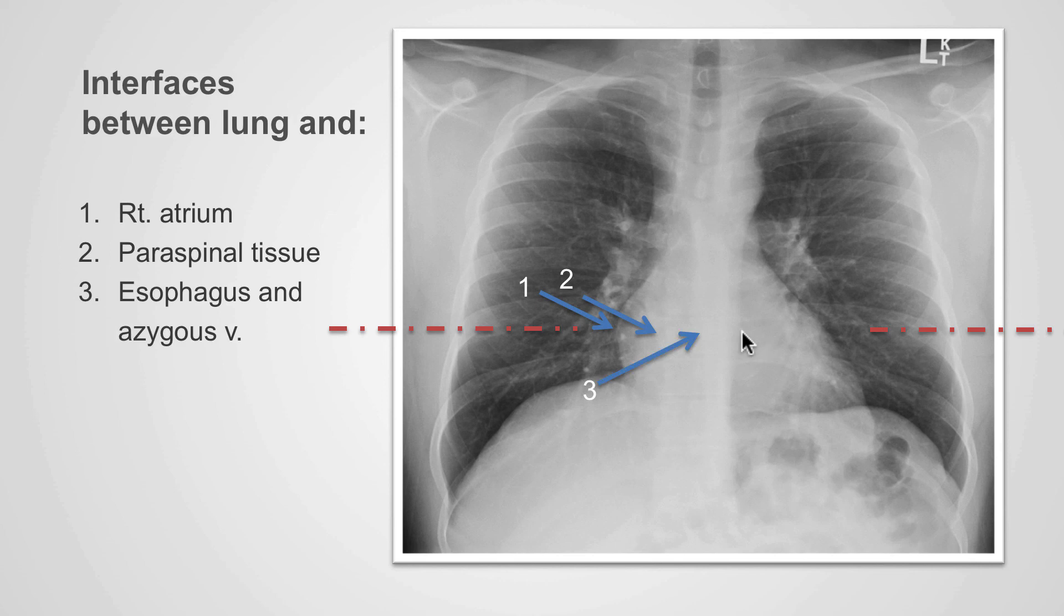Can you identify what is causing this interface? That is caused by the descending aorta. And at this level, that is caused by the left ventricle.